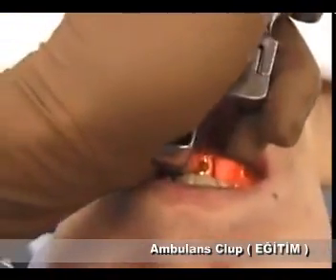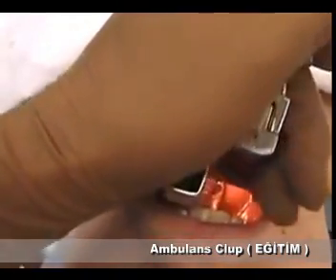Sometimes the laryngoscope is held low by the handle and the small and ring fingers may obstruct the view. This is avoided by properly holding the laryngoscope by its handle.